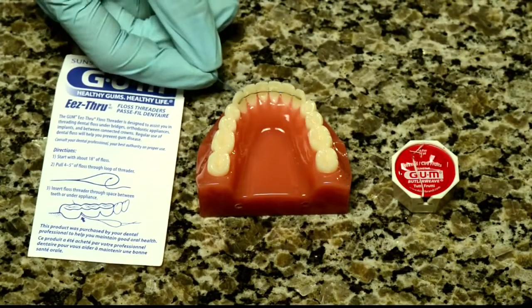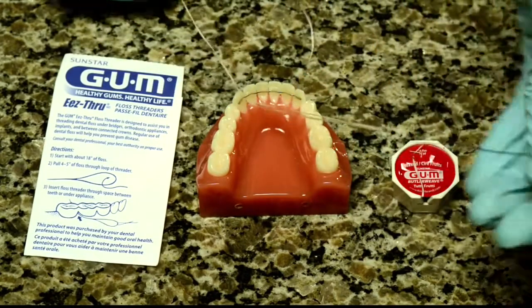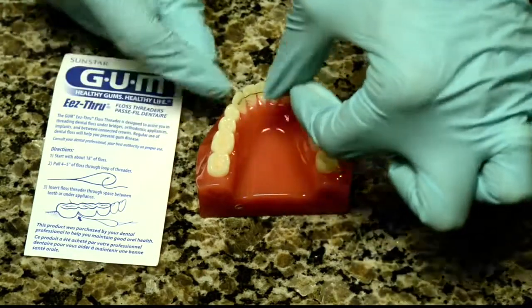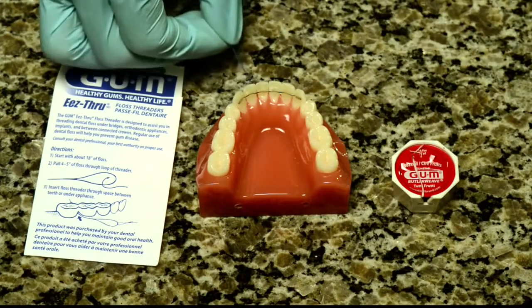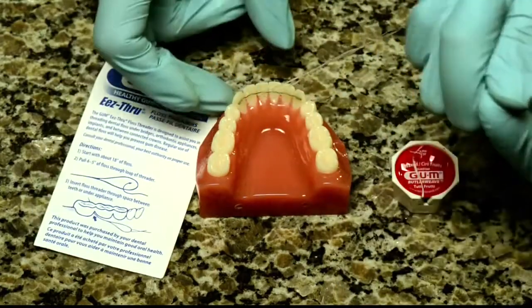Once the floss is in between the teeth under the bondable wire, you then hug one side of the tooth and move the floss up and down 3 times. Then hug the other side of your tooth with the floss and move the floss up and down 3 times on the other side. The floss in the floss threader is then pulled through and reinserted between the next 2 teeth at the gums.